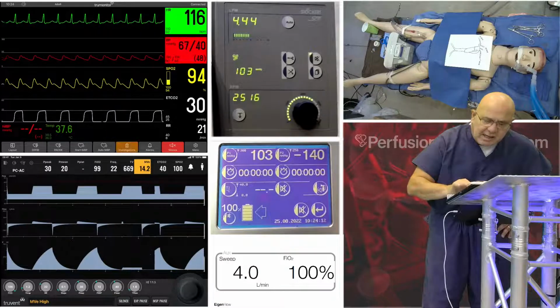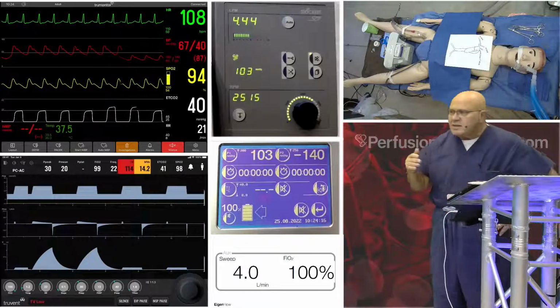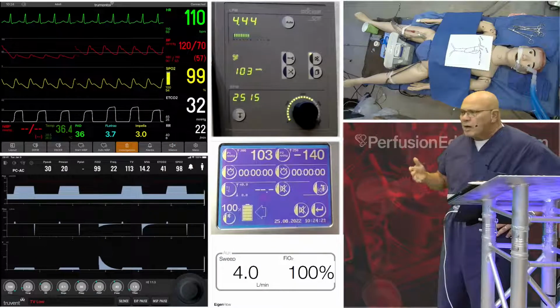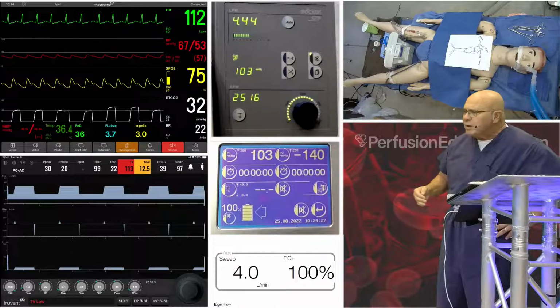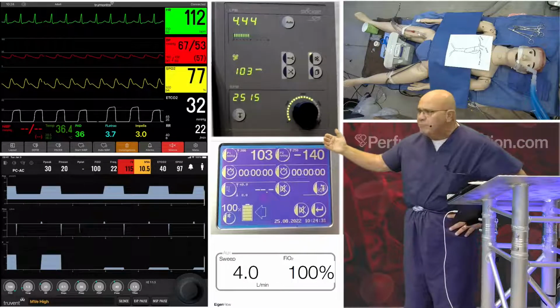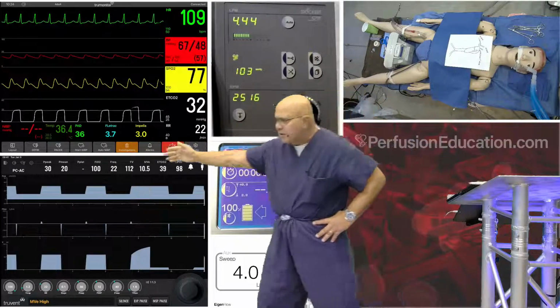The next day, however, there was a significant change. And this happened at about the 24-hour mark for whatever reason. Nobody really knows what exactly happened. But you can see that our ECMO flow hasn't changed. Everything is the same. The PAD has risen dramatically to 36.